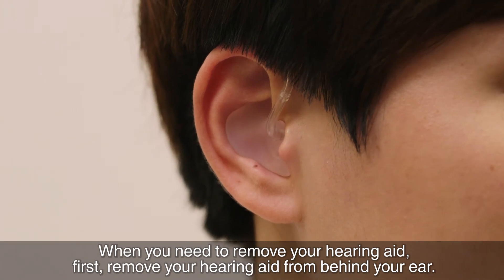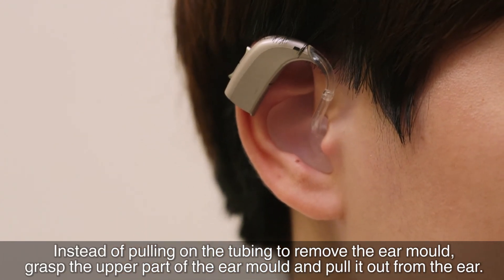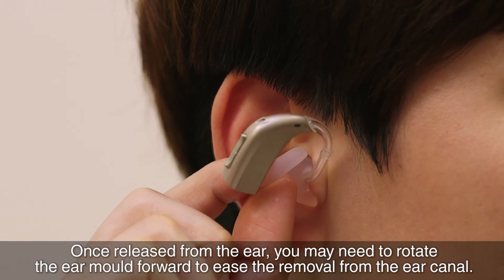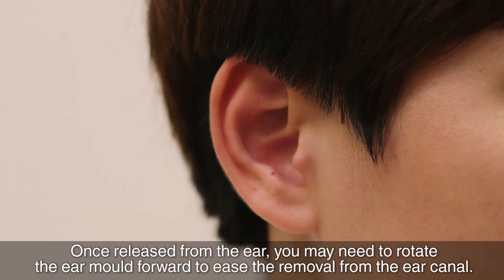When you need to remove your hearing aid, first remove your hearing aid from behind your ear. Instead of pulling on the tubing to remove the ear mould, grab the upper part of the ear mould and pull it out from the ear. Once released from the ear, you may need to rotate the ear mould forward to ease the removal from the ear canal.